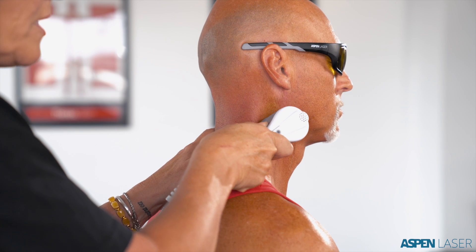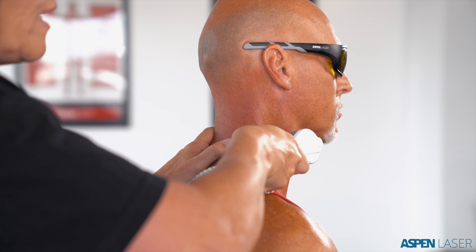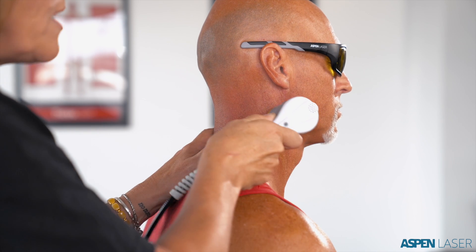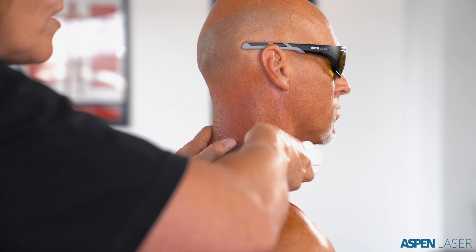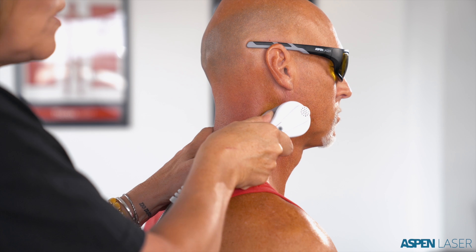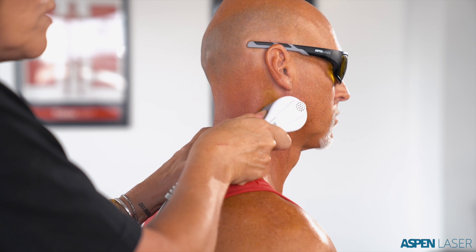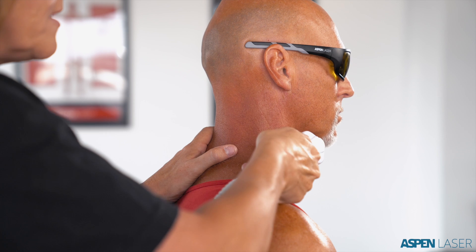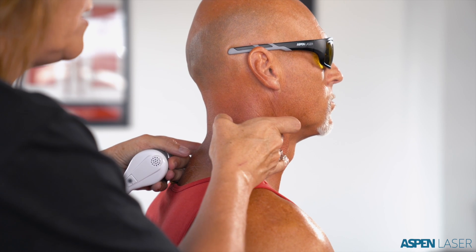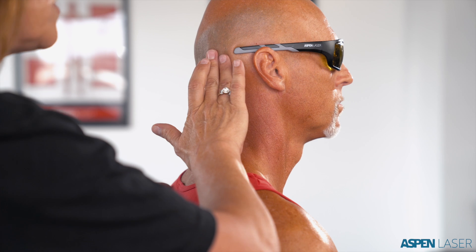This is my final step, which is palpation. An interesting thing is that when we treat the neck in this area, even though we're treating for pain, we're also treating over where the vagus nerve exists. The vagus nerve is an autonomic nervous system function nerve pathway, so by treating this area we get two benefits: we reduce pain locally and we get a neural-mediated anti-inflammatory response by directly treating over the vagus nerve. At two and a half minutes, I palpate this area — what's your pain there? Zero. So I'm at a pain scale of less than one in the neck, the base of the skull, and the area where he originally felt pain. It took two and a half minutes per location — in seven and a half minutes I've completed therapy and the client is pain-free.